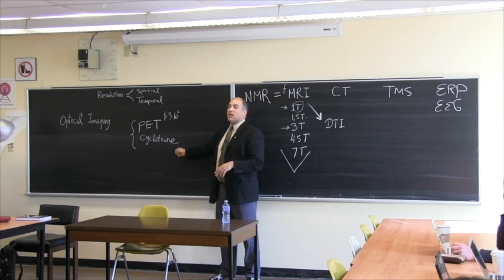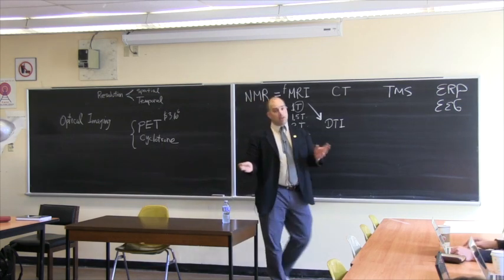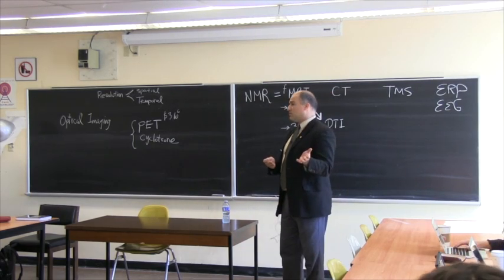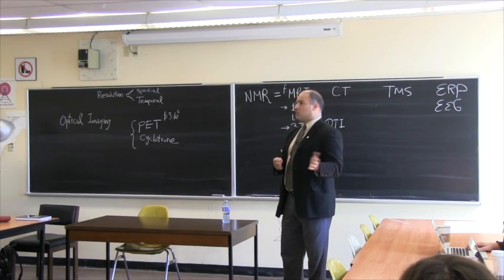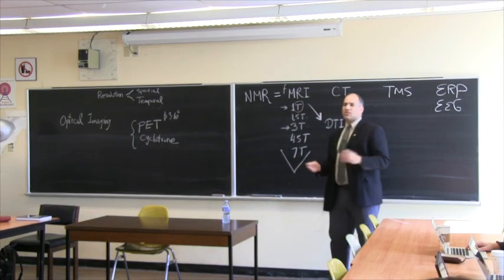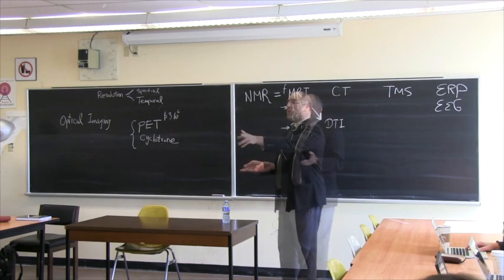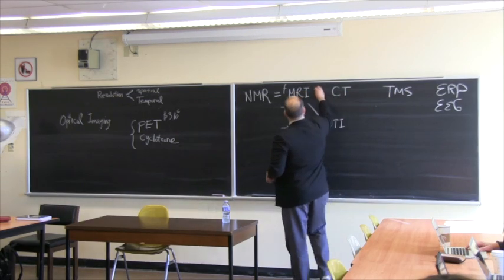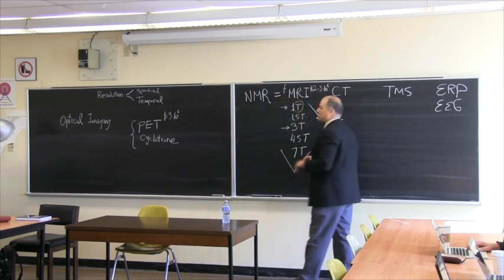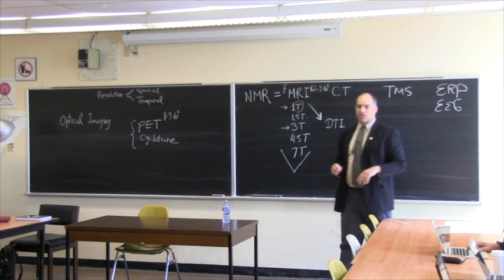But just so that you understand, to have a cyclotron, by the way, you need a chemistry department, and you need nuclear medicine because they need to manage radioactive material. So you need the whole facility. It's very expensive. How much is an MRI, more or less? Okay, between 2 and 3. Usually a good MRI is between 2 and 3 million, just about. I mean, sometimes you need to do some installation and stuff like that, which costs a little bit more.